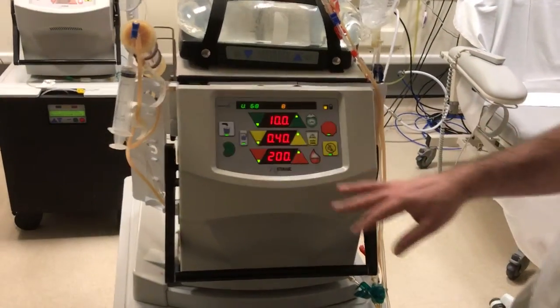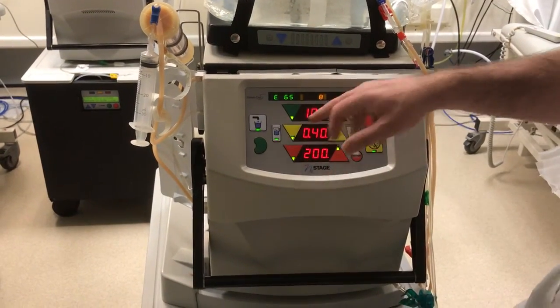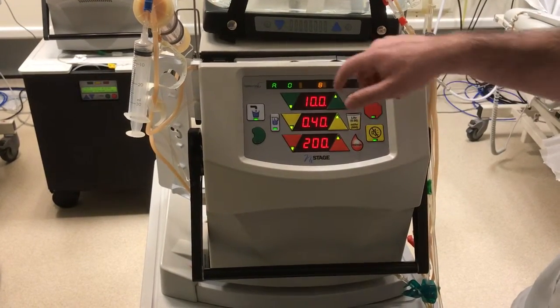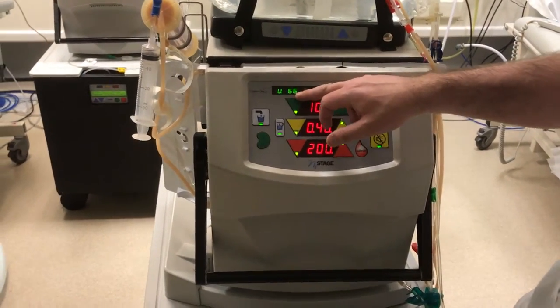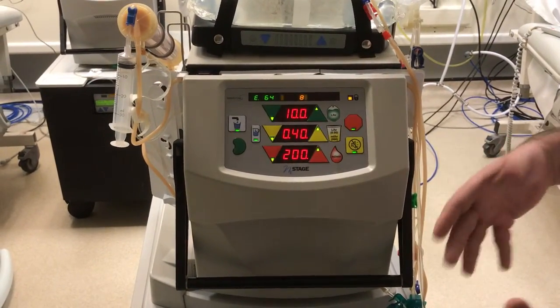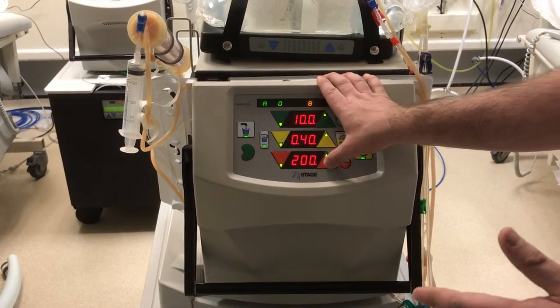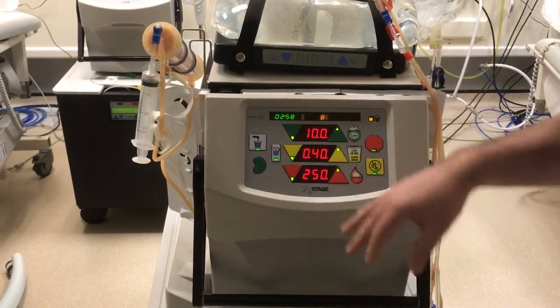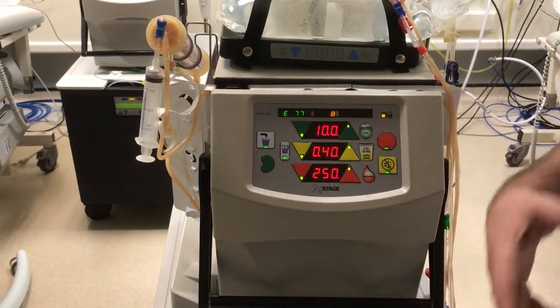Once all your drugs have been given, we can look at our pressures and blood flow. As you can see here as it goes around, we've got our arterial pressure which is quite low at the moment — that's fine, it will go up. Then we've got our venous pressure, which is 66. Roughly you want the venous pressure to be half of the blood flow, so we can start to turn the blood flow up in about 50ml increments. Turn it up, look at your venous pressure, look at your arterial pressure, reassess, and keep reassessing until you achieve the blood flow that you require.